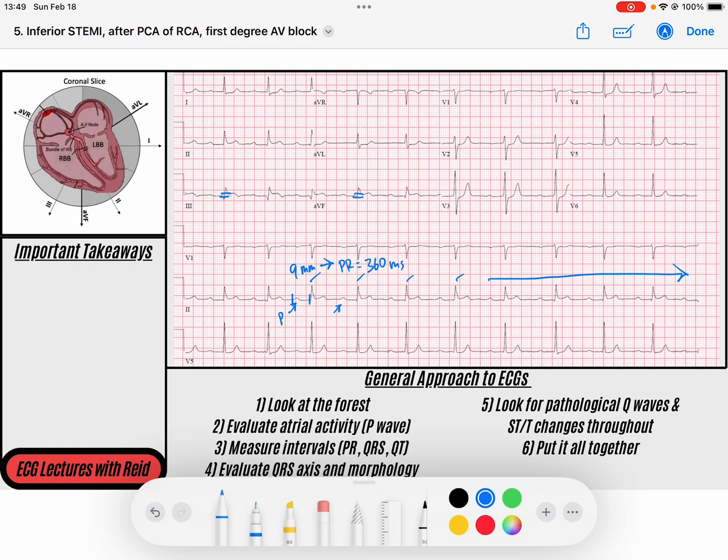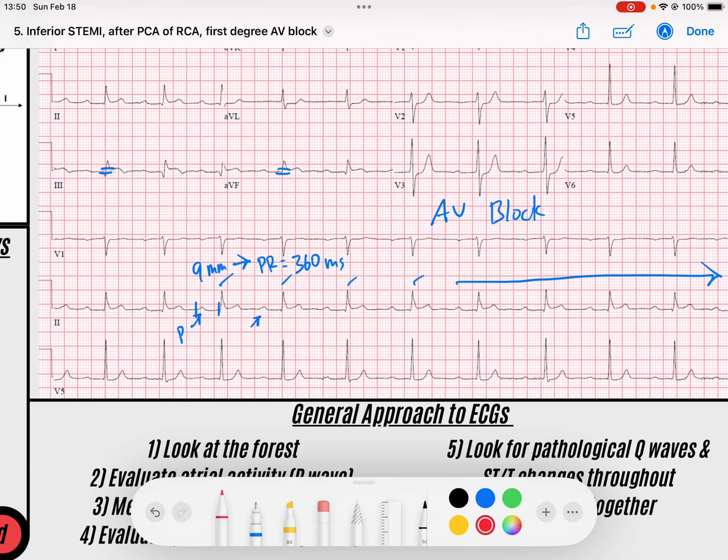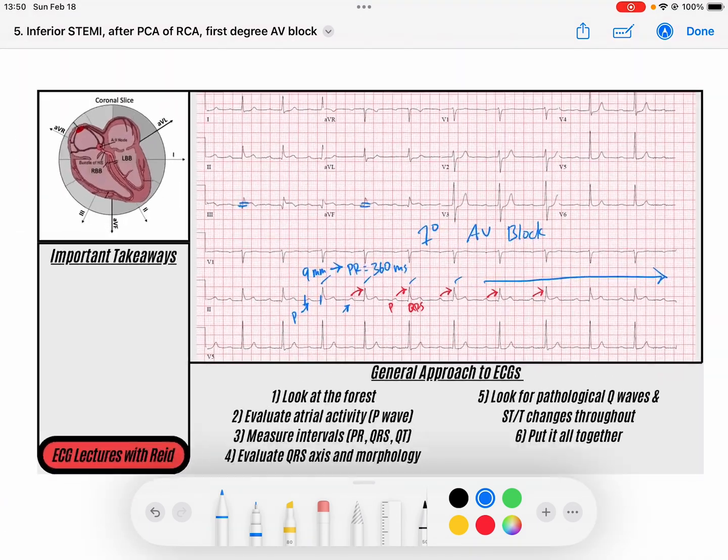And so that's greater than the maximum limit of normal, which is 200 milliseconds. So we have an AV block of some sort, meaning that the AV node is taking slower time. And so we look to make sure that every single P wave conducts to a QRS and that there are no other P waves that do not have QRSs. And we don't see that here. And so we see that this is every P to every QRS. It's just taking a little bit longer. And so this is a first degree AV block.